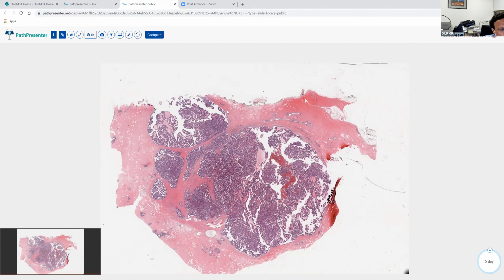When that is very minimal, you can then say that this is papillary DCIS with foci, depending on your comfort level and confidence level, you would say with foci suspicious for, or with foci of micro-invasive carcinoma. That is how the micro-invasion will look. Now, in some cases, because this is growing by pushing, it is constantly trying to push. So at some point, maybe this basement membrane gives way, and then this is invading into the stroma.